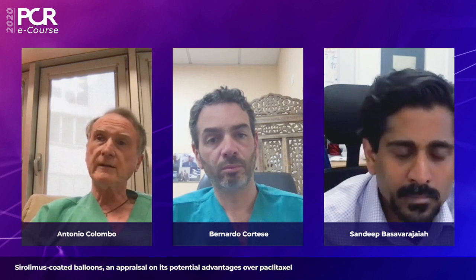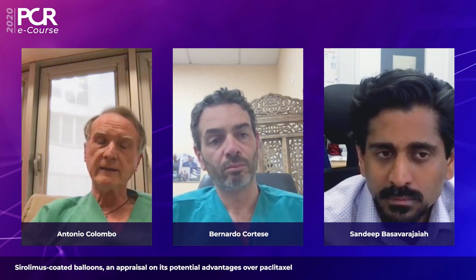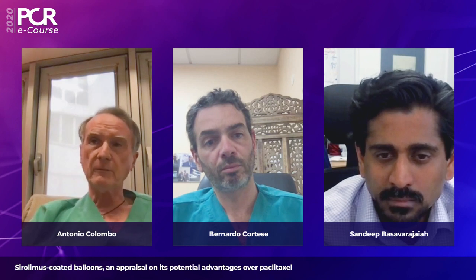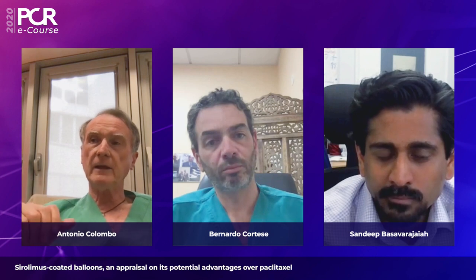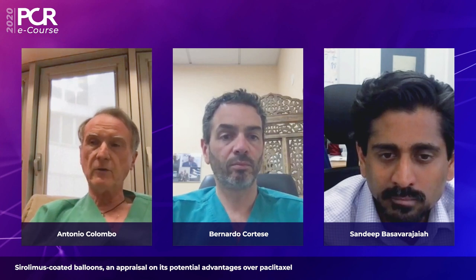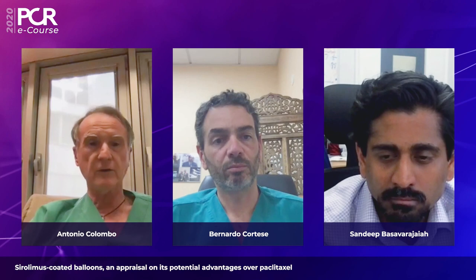And please do not dismiss also the fact that drug-coated balloon does not demand long-term dual antiplatelet therapy. And this technology, even if we did not cover this aspect in this symposium, is a good alternative in patients who cannot take long-term dual antiplatelet therapy, who may need immediate surgery or some other procedure, or they are at high risk for bleeding. So drug-coated balloons are not an alternative to stenting, but are a good way to improve the result of revascularization with catheter-based technologies.